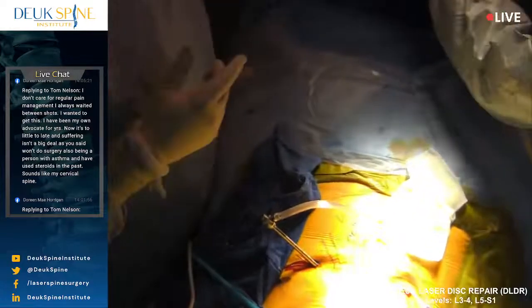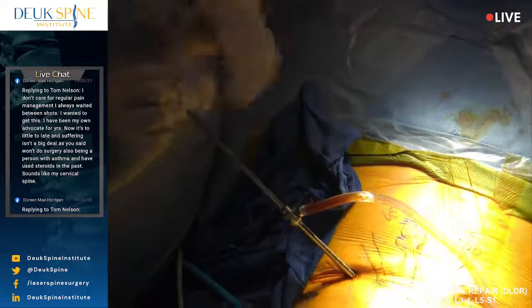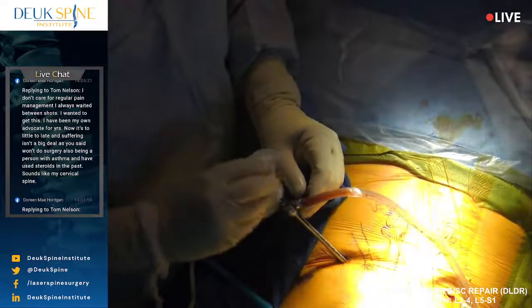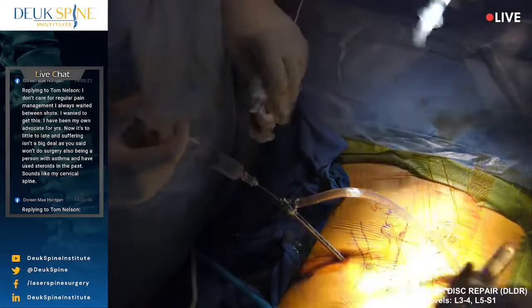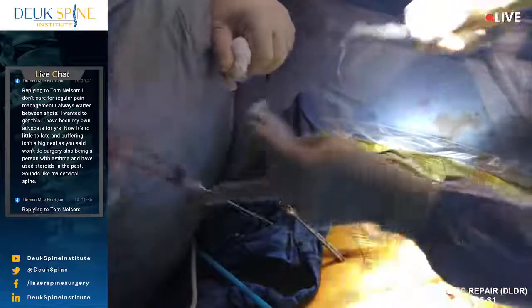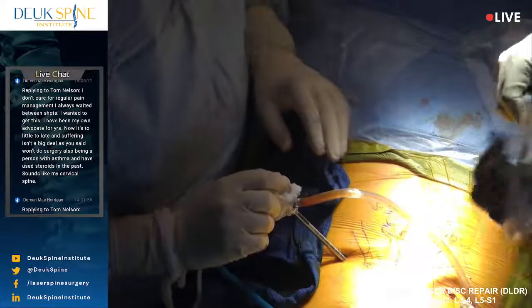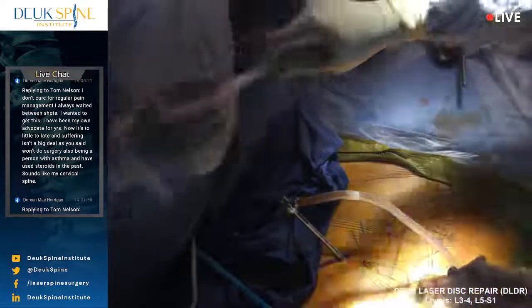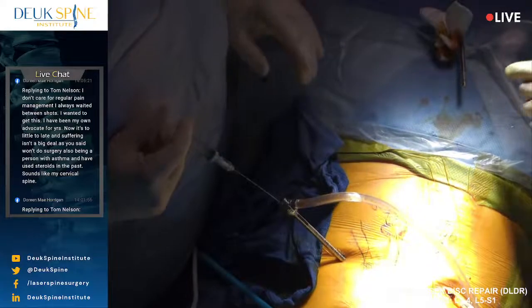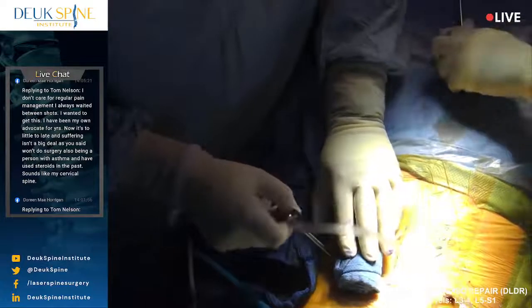How's our patient doing? We're just putting a little antiseptic in. It's antiseptic developed right here on the Space Coast of Florida at NASA called betadine. And we've talked about it a few times. It's what NASA developed to fight off the microbes from space that the astronauts might bring back with them. Invasion of the body snatchers kind of stuff.